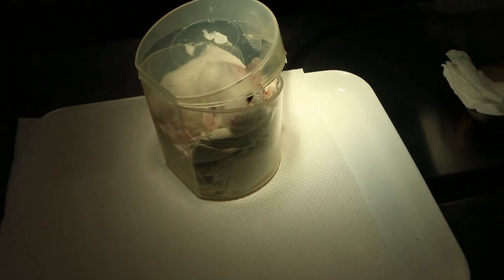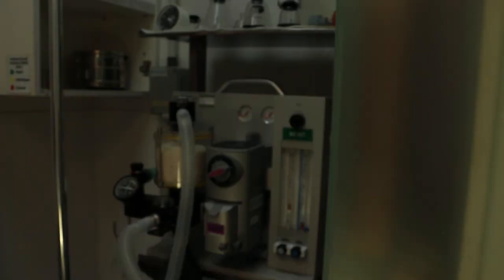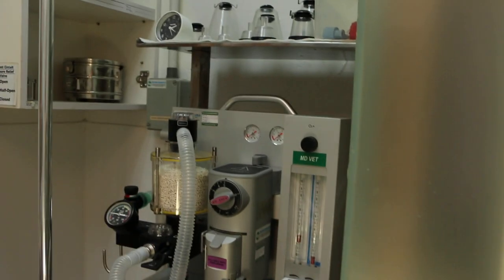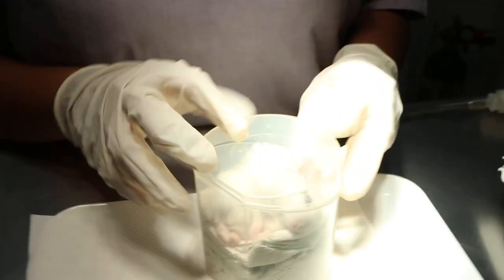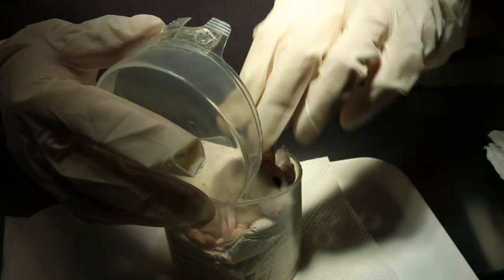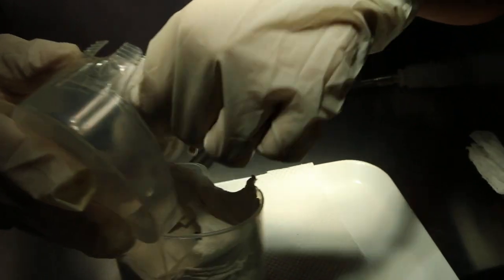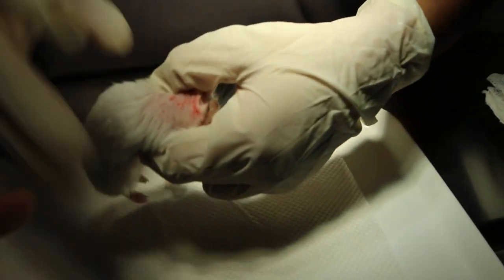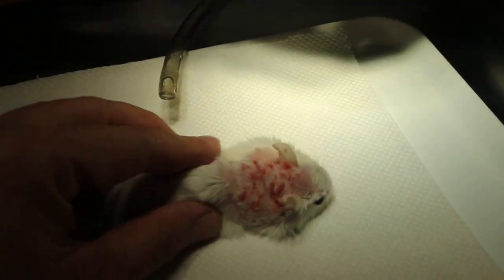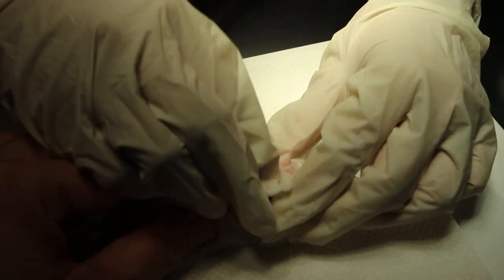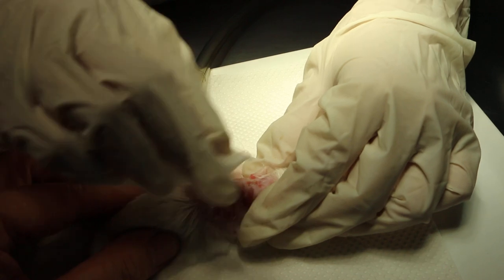Right now we are putting isoflurane gas 5% and it's going down really. So once it's down we quickly put it out and use a lot of water to wash away all the dirt, all the cream.